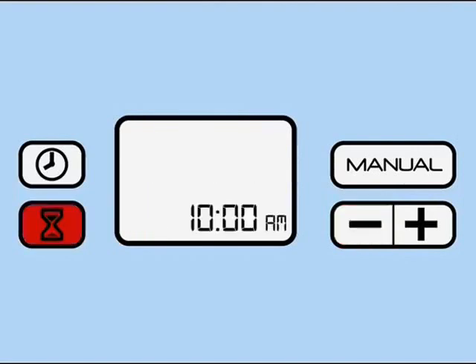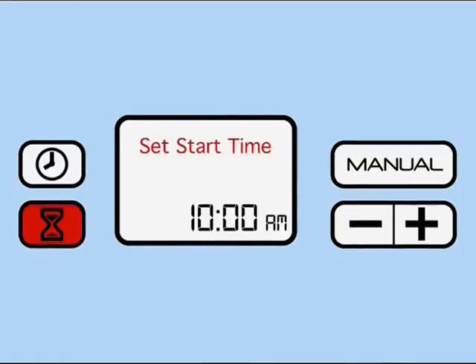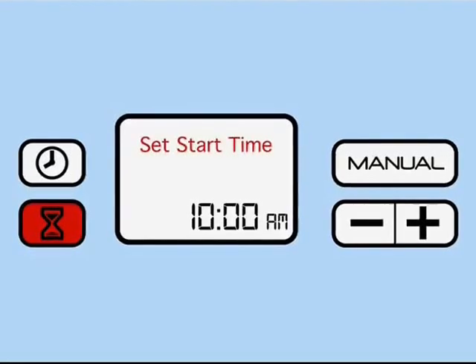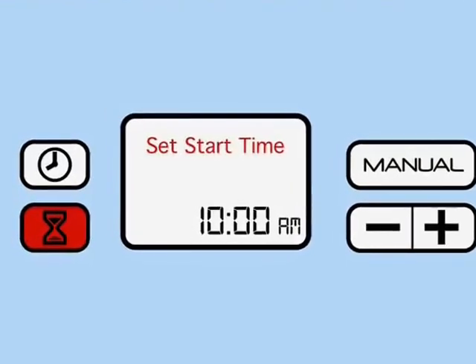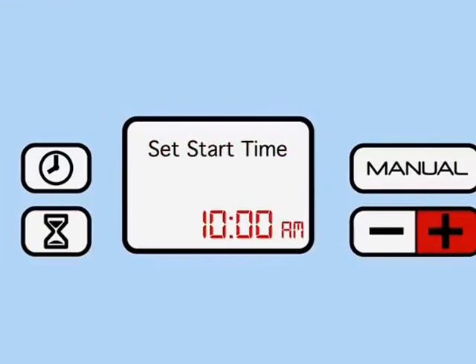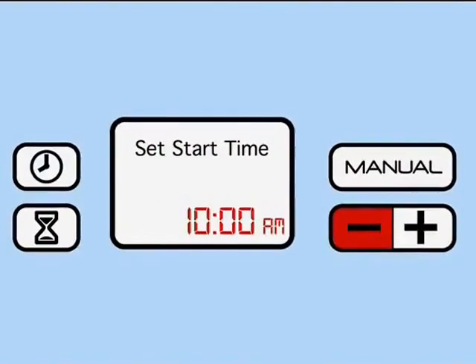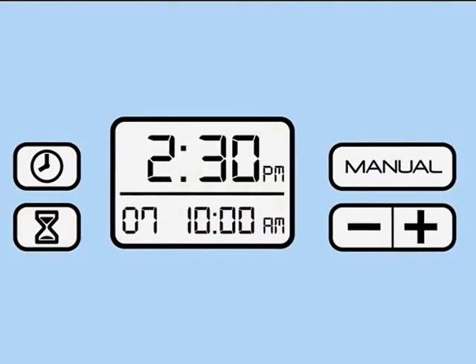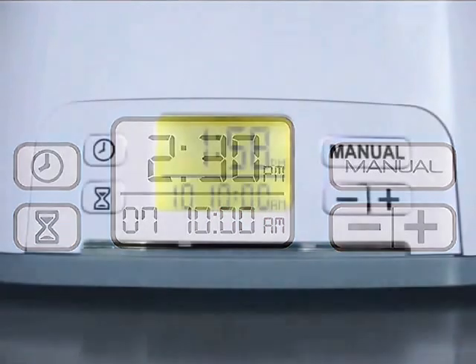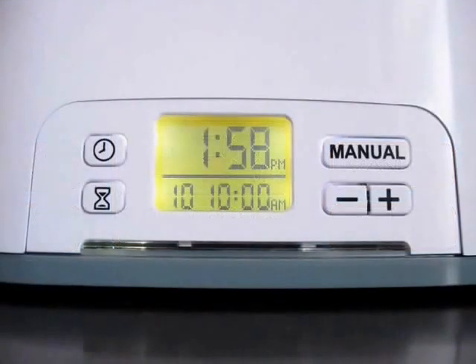Now push the hourglass button once more to set the time of day you'd like your soak clean to begin its cycle. Use the plus or minus button to reach the desired time. Finally, press the hourglass button one last time to store your settings and return to the home screen.